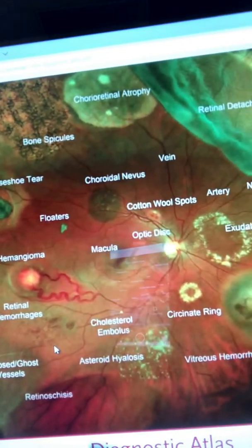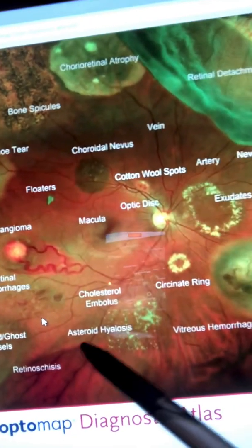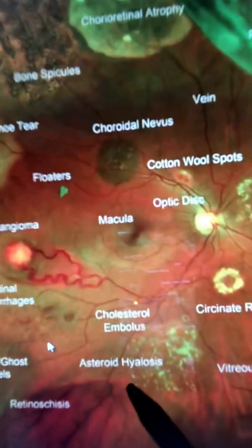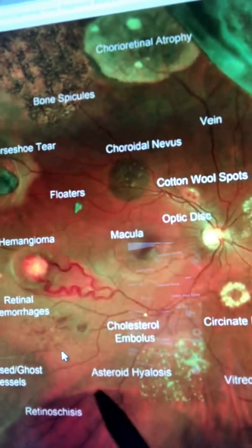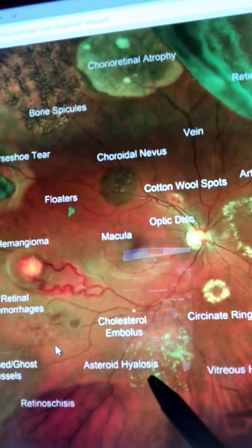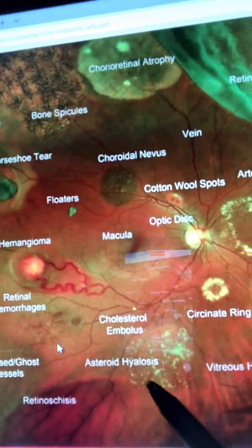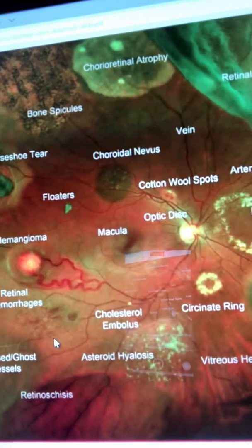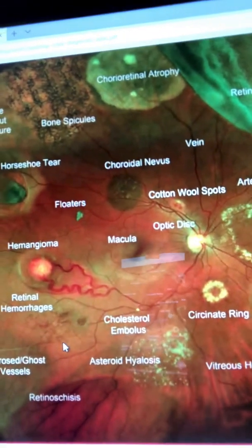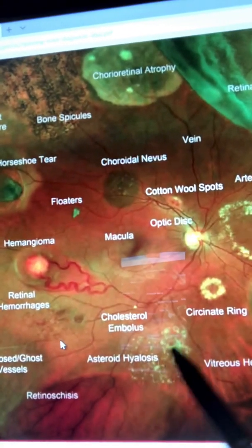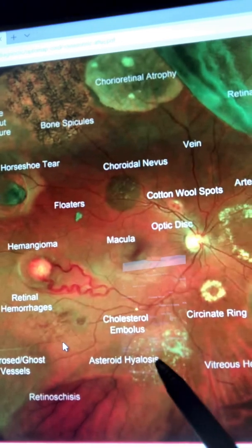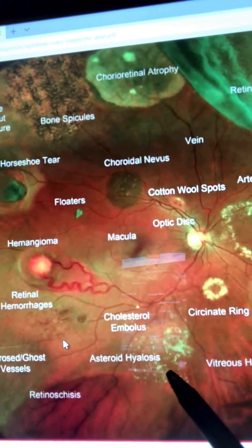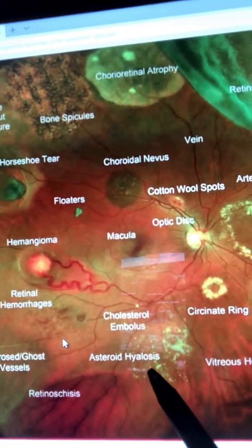Another thing I see through the Optomap is asteroid hyalosis — right here. These are tiny depositions of calcium in the vitreous and it does not necessarily cause loss of vision, but the view can be very blurry. When I see asteroid hyalosis I have to ask the patient to get their blood calcium levels and parathyroid hormone levels checked.